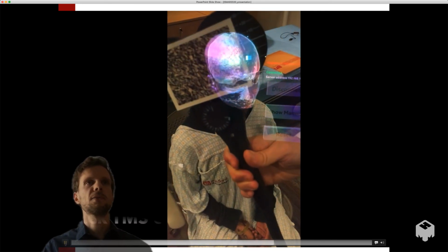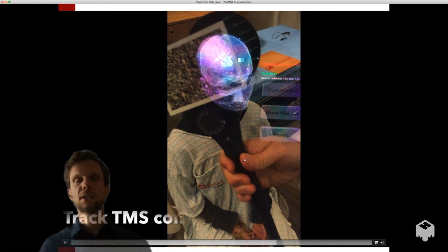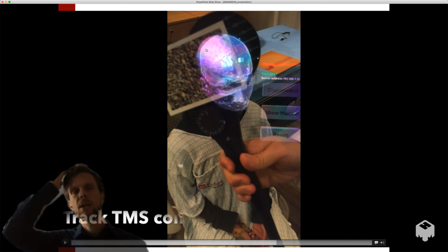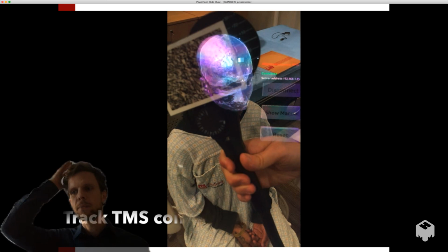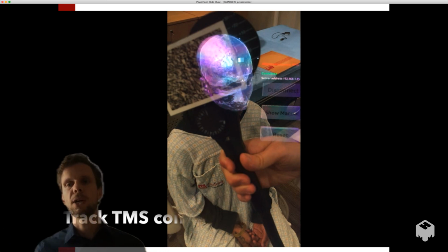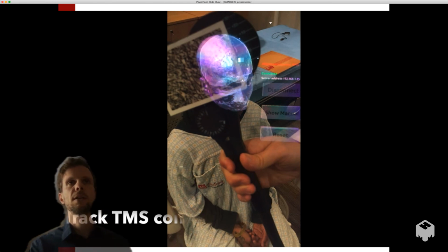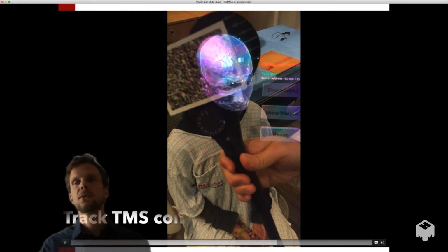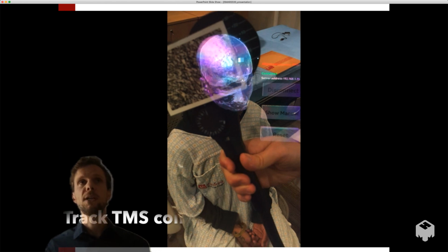And now, I'll pause for a second, now we have this electromagnetic coil. This medical application that we are trying to guide is so-called transcranial magnetic stimulation, where you have an electromagnetic coil that you place close to the head, and the electromagnetic field then induces currents in the subject's head. So it allows you to stimulate the brain from the outside without actually opening the head. And the focal point of this TMS coil that we're using here is about the size of a quarter. So 5 millimeter target accuracy, or even less than 5 millimeter target accuracy that we have achieved, is actually really good for guiding this technique.